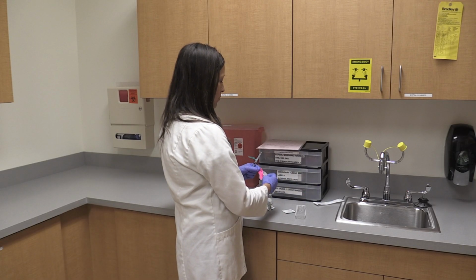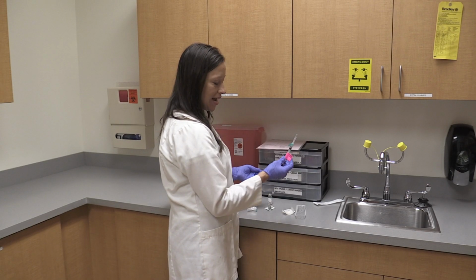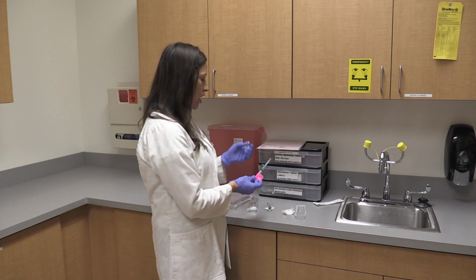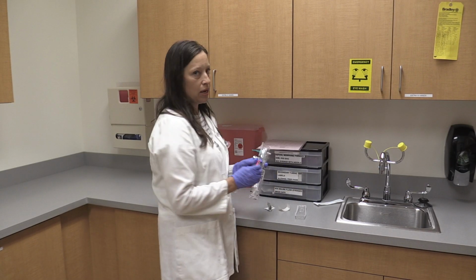So now that I've confirmed all of that, I'm going to take a med label with my initials, the patient's initials, the date and the time, and I'm going to take my medication vial because I need that for when I scan for my third check. And then I'm also going to take my 2 saline flushes. And then we're going to go back to the patient's room.